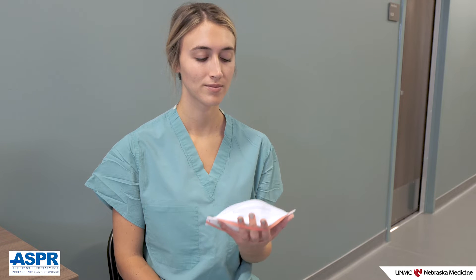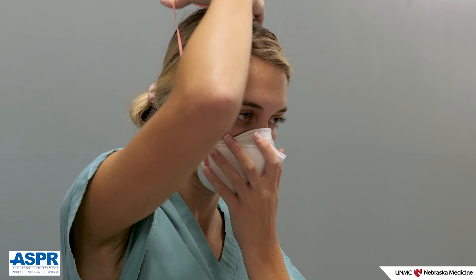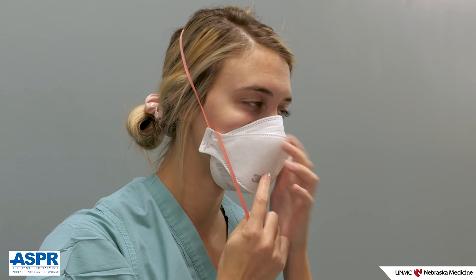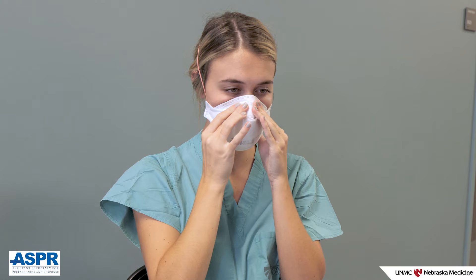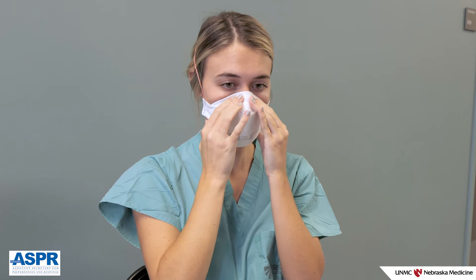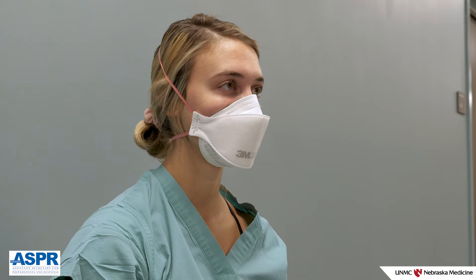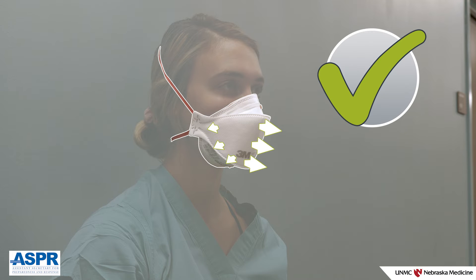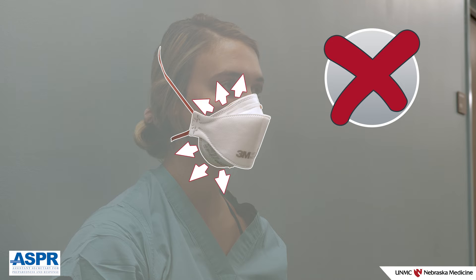To don an N95 respirator, grip the respirator in your non-dominant hand. Hold the respirator to your face, covering your mouth, nose, and chin. With your dominant hand, position the top strap at the crown of your head. Place the bottom strap at the nape of your neck. Move any hair beneath the bottom strap so the strap is in direct contact with your skin. Using both hands, mould the nose piece across the bridge of the nose and below the eyes. When the N95 is positioned comfortably and securely, perform a user seal check. Place your hands over the respirator, covering as much surface area as possible, and exhale gently into the respirator. The seal is considered effective if you feel a slight positive pressure inside the N95. You should not experience air movement on your face along the edge of the N95, or fogging of your glasses if worn.